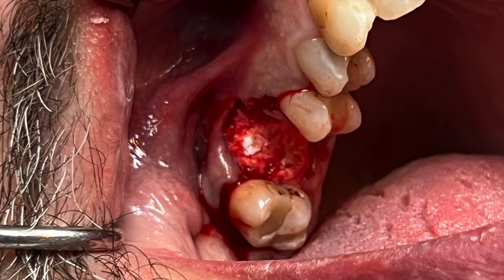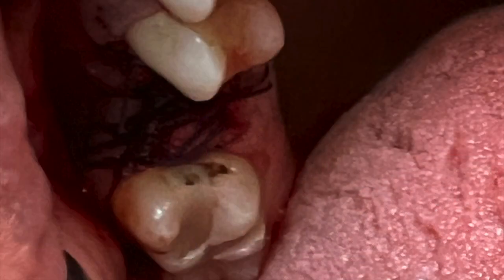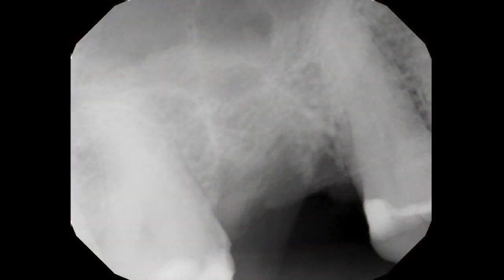I'm not concerned about primary closure whatsoever. We will suture with some interrupted sutures, take a post-operative radiograph, and we will evaluate this site in a short three to four months to determine whether it is adequate for placement of a dental implant and restoration.